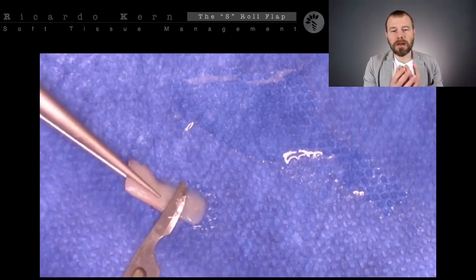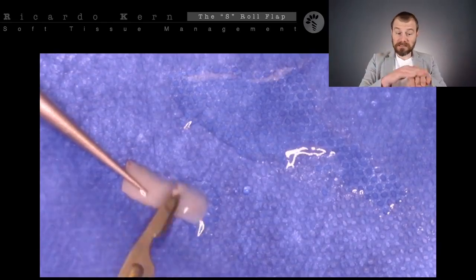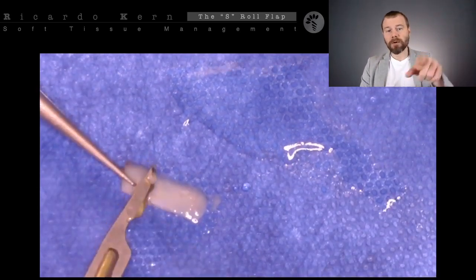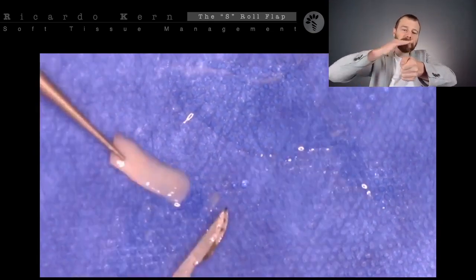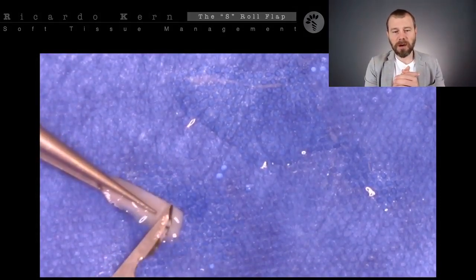Some people like to use a wood tongue retractor because the grip of the wood is very nice. So that is good for you to use. Or you can use a micro plier and align the micro plier exactly in the same direction that you are doing the deepithelialization process. So that is also going to work pretty well, okay?